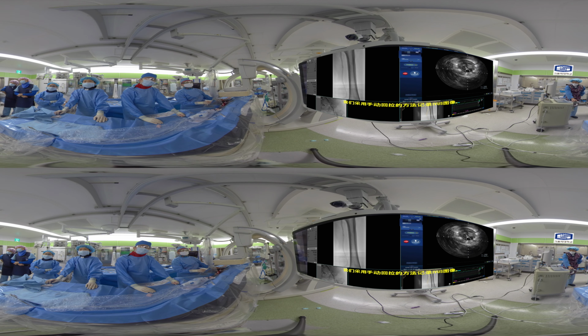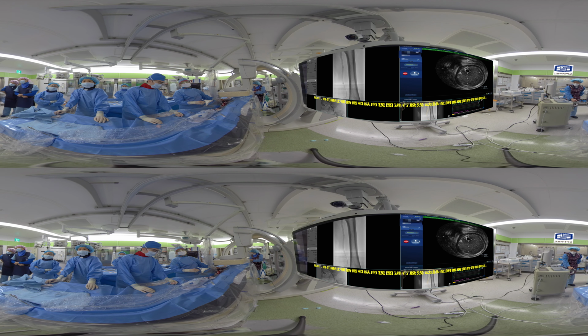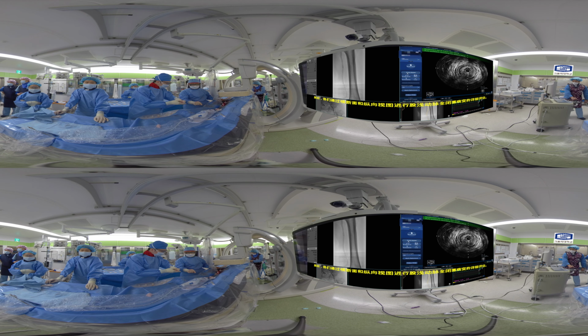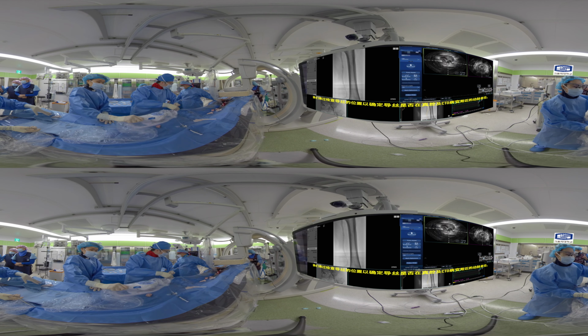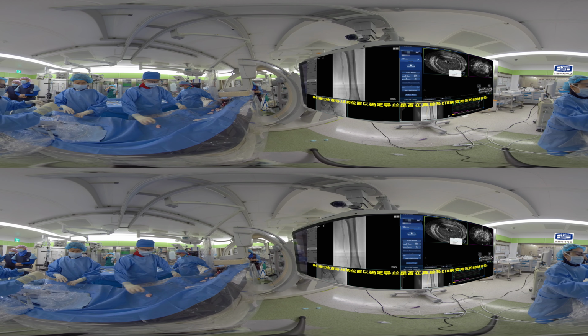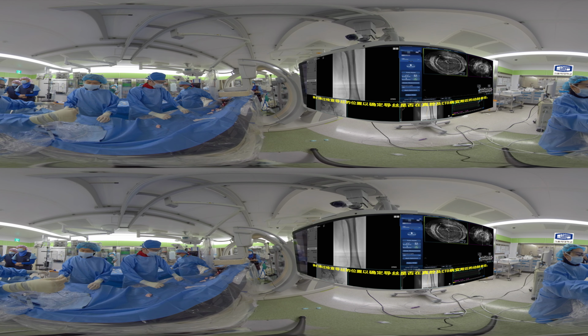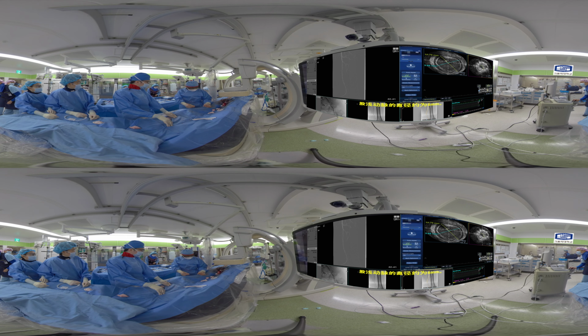We recorded the IVUS image by the manual pullback method. And then we carefully evaluated the occluded SFA with transverse and longitudinal views. We checked the wire location to confirm the intraluminal position of the wire and the diameter of the artery along the CTO lesion. Diameter of the SFA was around 6 mm.